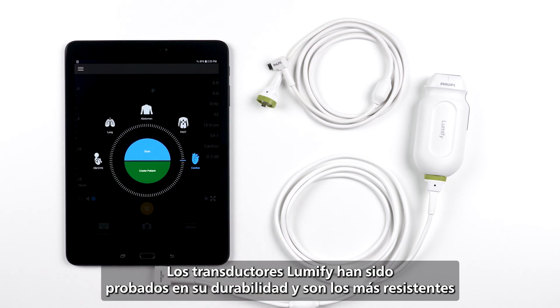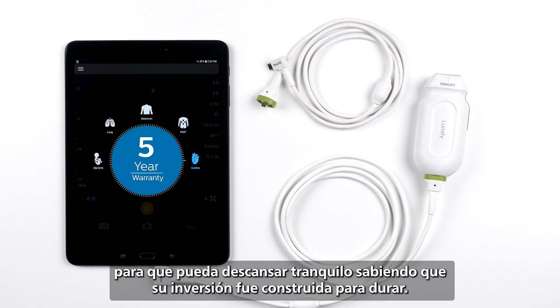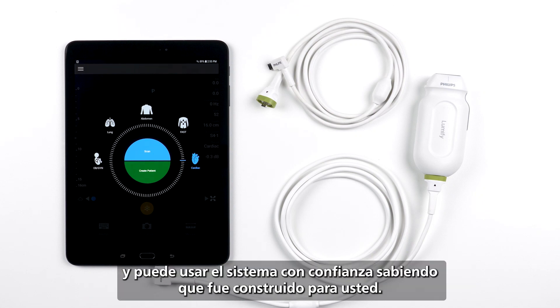Lumify transducers have been durability tested and are the toughest Philips has ever built, backed by a standard five-year warranty so you can rest easy knowing your investment was built to last. Now you know a bit more about your Lumify transducers, and you can use your system confidently knowing it was built for you.